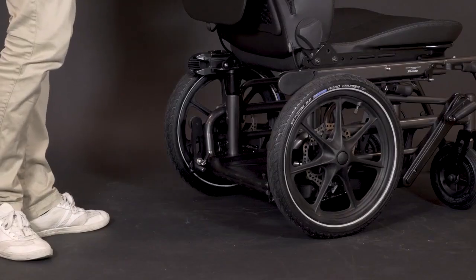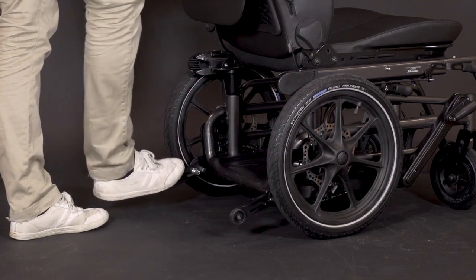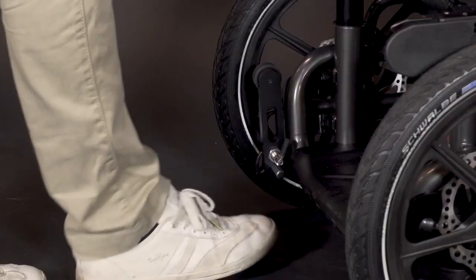I also want to talk about our anti-tip protection. Use your feet to fold them down, and when you need to take them away, use your feet again.